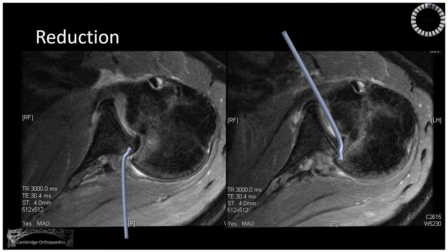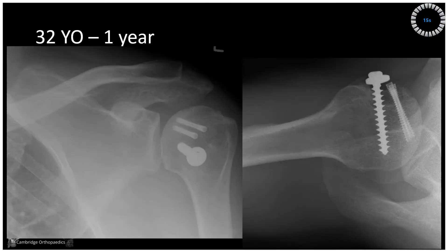Four months following the injury, consider ways you may reduce the shoulder and hold it. Here are post-op radiographs one year following surgery.